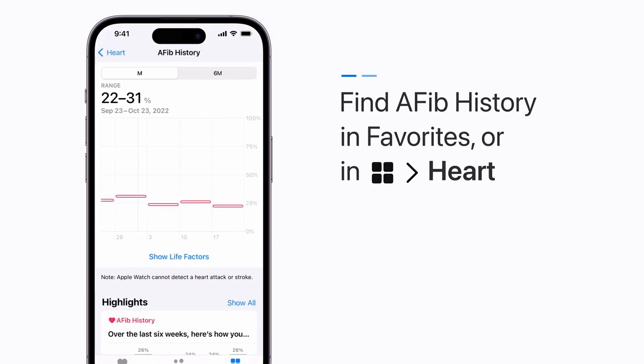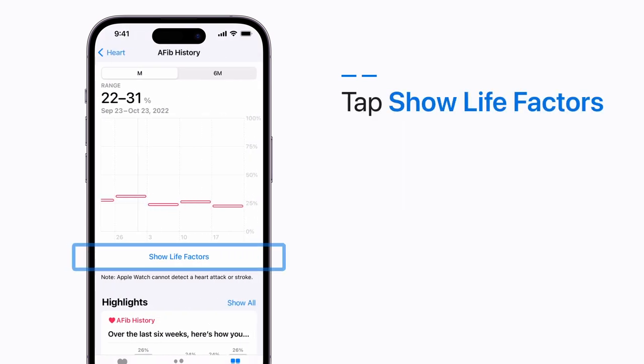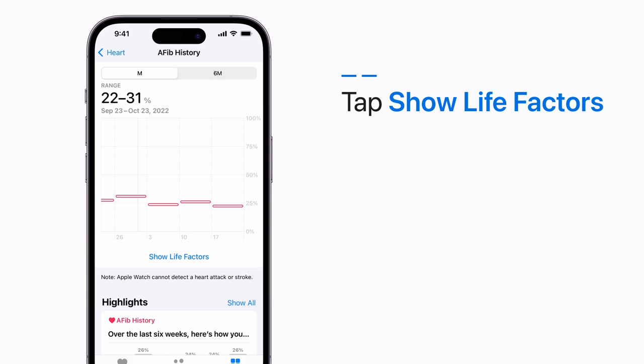You can also tap Show Life Factors below the results to understand how key factors may influence your condition.